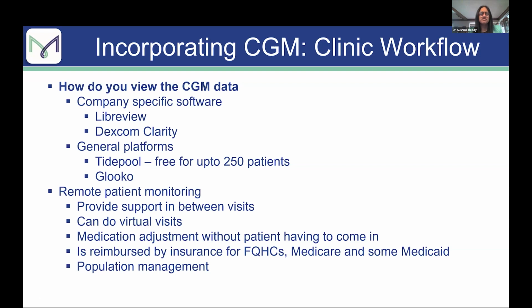If it works for your patients, there's also a way to do remote patient monitoring using these platforms, where you can look at their data, do medication adjustments, and there is reimbursement for this for some of the insurances as well. So just remember that that is a possibility as well.